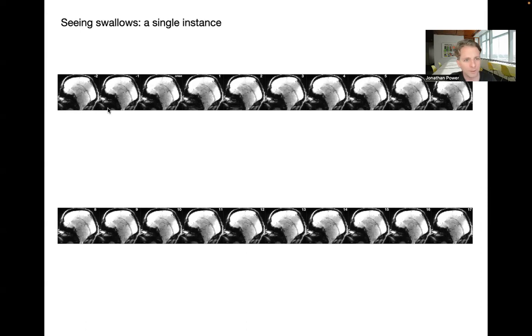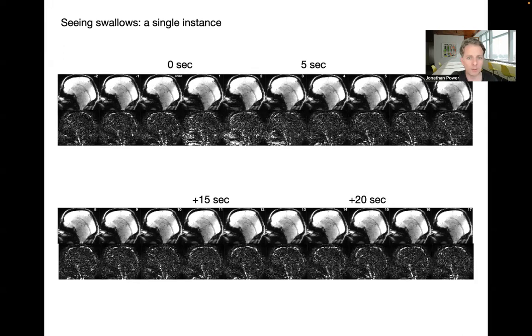So you can see the tongue there, the tongue there, the tongue there, and all of a sudden slabs and slabs, and then it gets back to being a tongue. So this is a swallow. And because we've scanned so much of the face, we can actually see this happening in our scan. If this were played as a movie, it'd be pretty easy for you to see, but because that probably won't work on a Zoom recording, I'm going to show you the differentiated images instead.